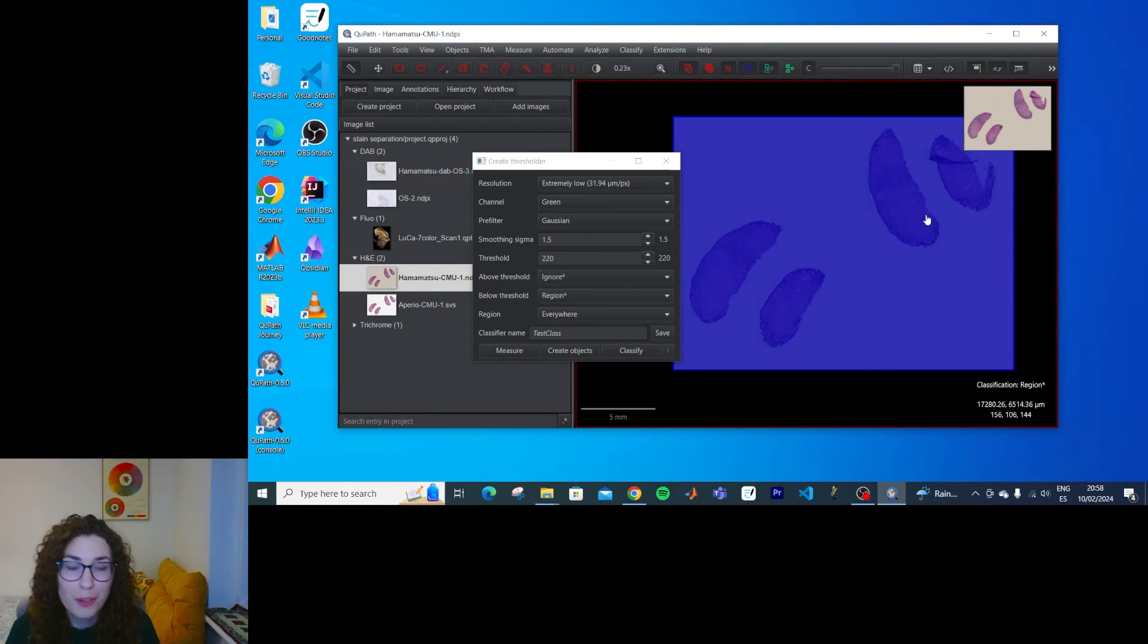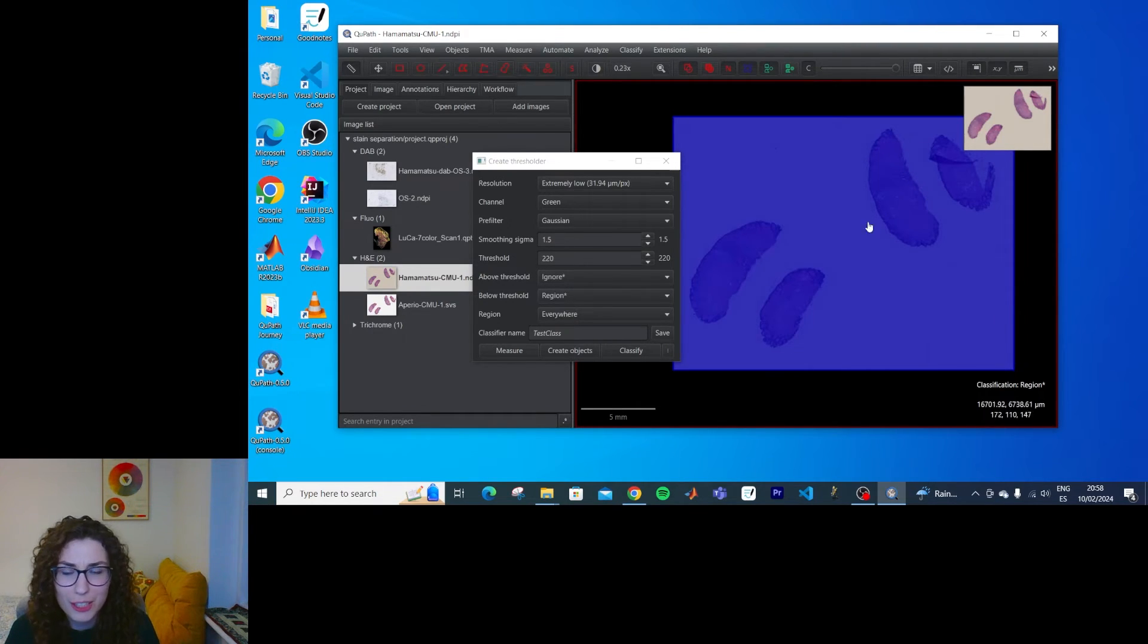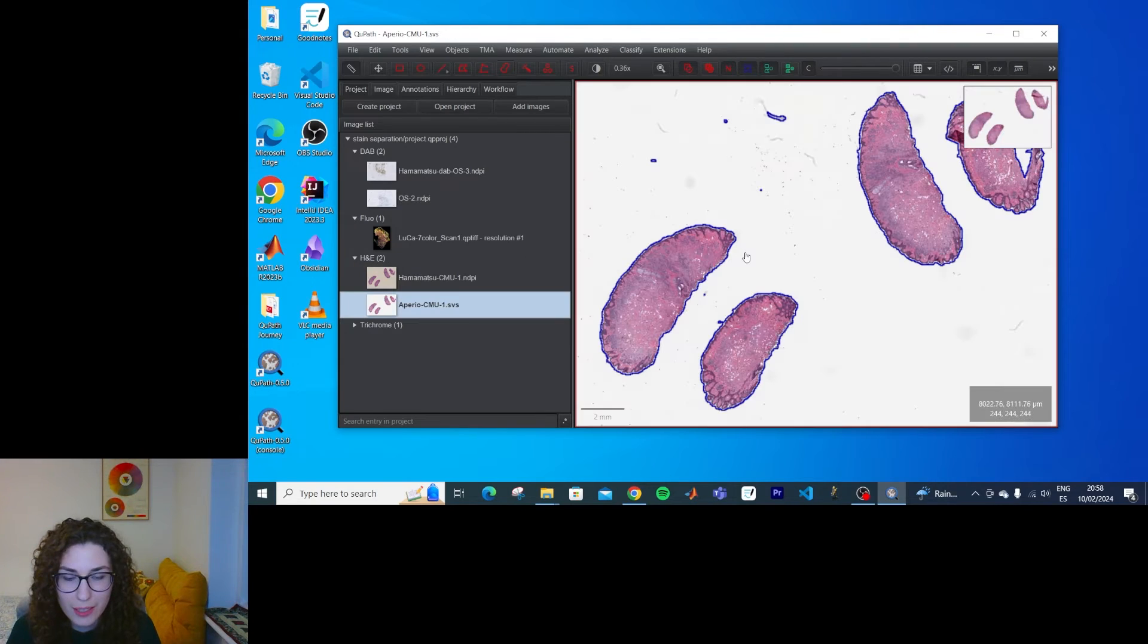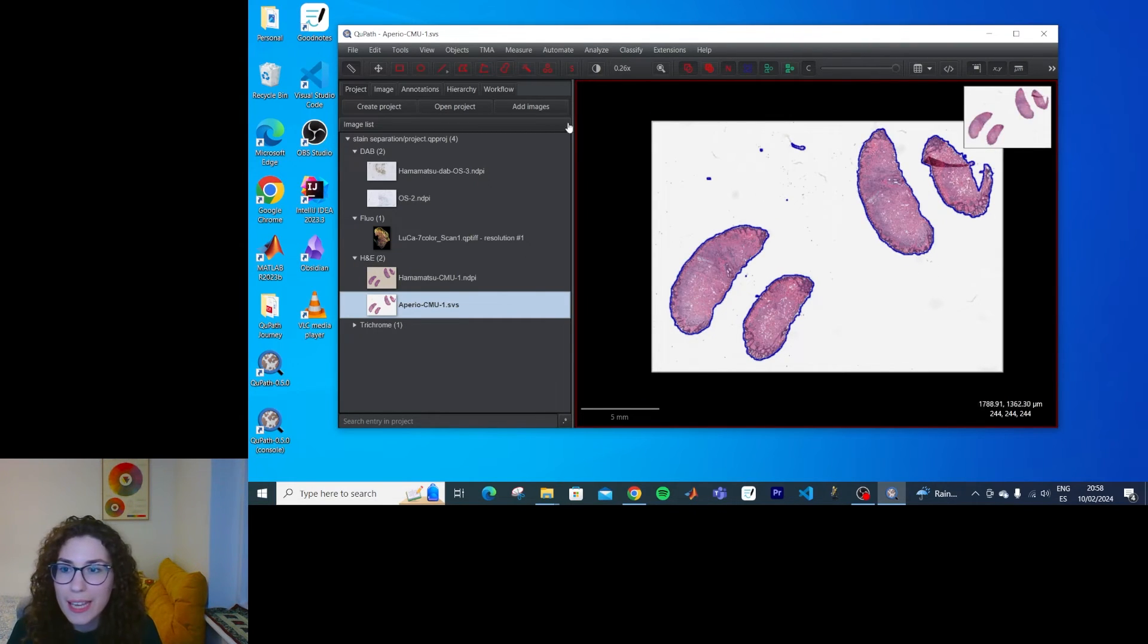So yeah, another proof that different colour profiles are dangerous when analysing images in batches. Let's go back to world one.